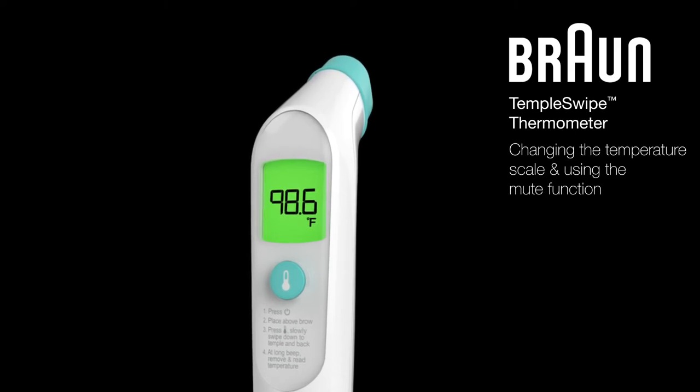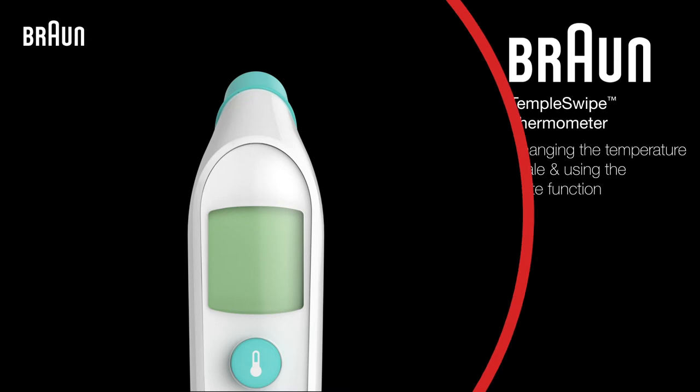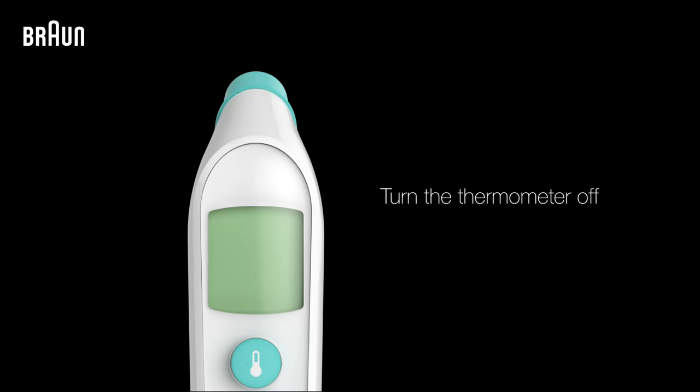With the Braun Temple Swipe Thermometer, you can change the temperature scale from Fahrenheit to Celsius and silence the thermometer in a few simple steps. To start, make sure the thermometer is powered off.